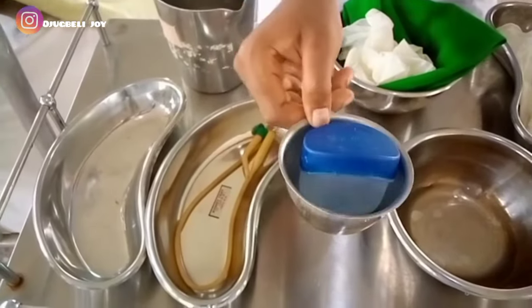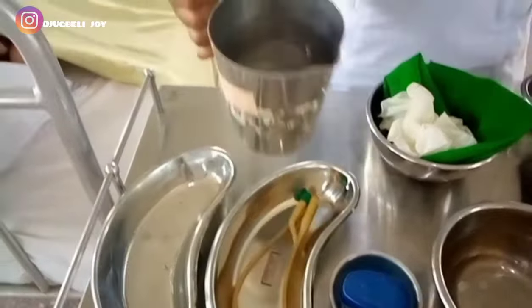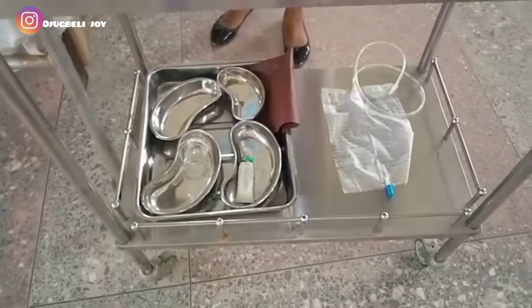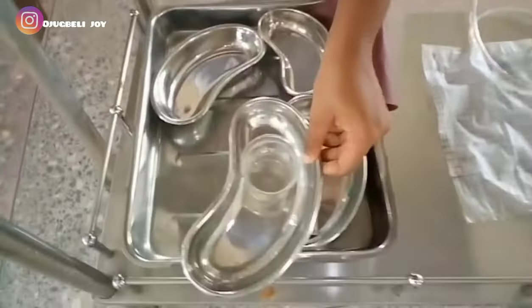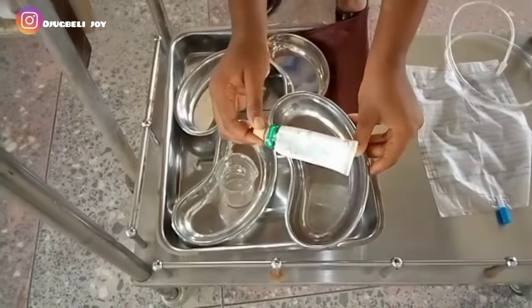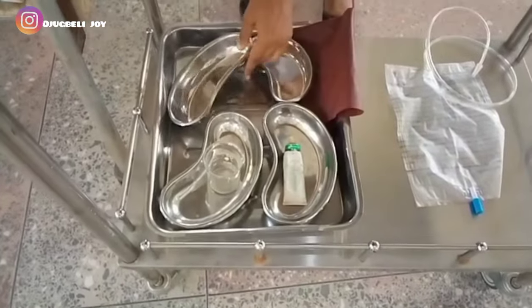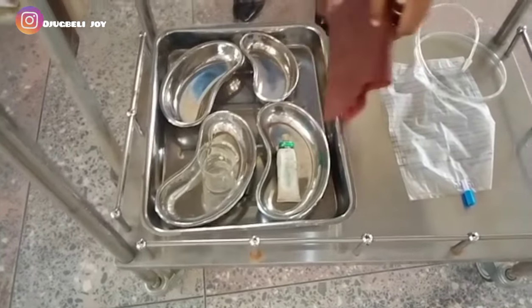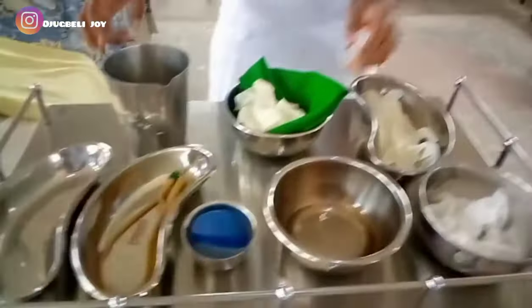We also have a receiver containing a catheter — two catheters depending on the size of the patient — a gallipot for lubricant such as liquid paraffin, and a receiver for urine with a one-litre measure jug. For our bottom trolley, we need a tray containing a specimen bottle for laboratory use, a receiver containing Dettol cream, another receiver for used swabs, another for used catheter, and a dressing mackintosh and torch.